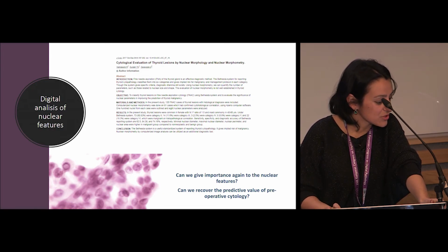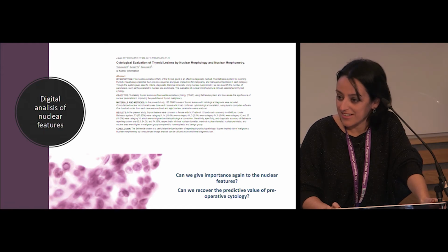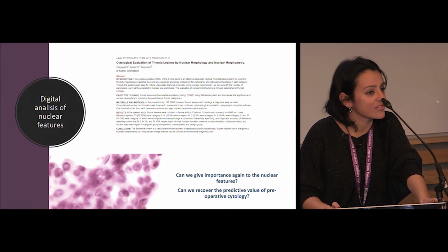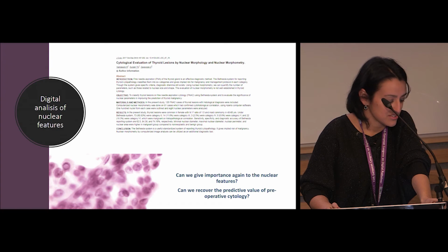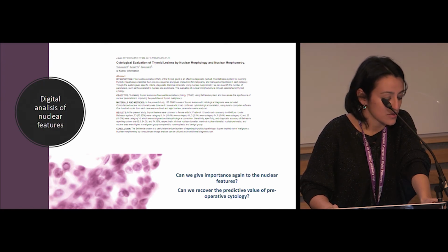Now I have 3 provocative slides for people from the IT area in the audience. First, please consider including in your studies the analysis of the nuclear features of thyroid lesions. Maybe with further characterization, we can give the nuclei back the importance they deserve, and we can help cytology recover a bit of its predictive value.